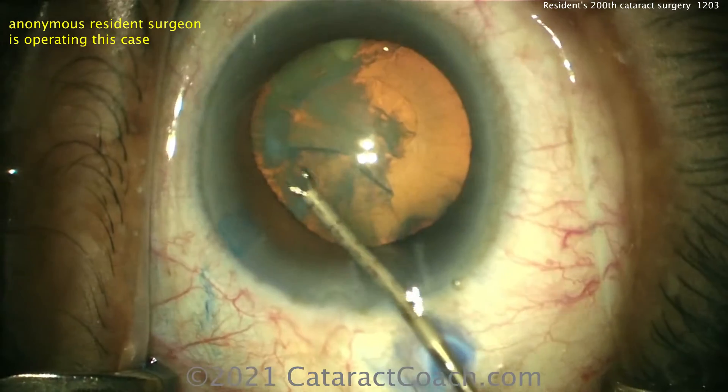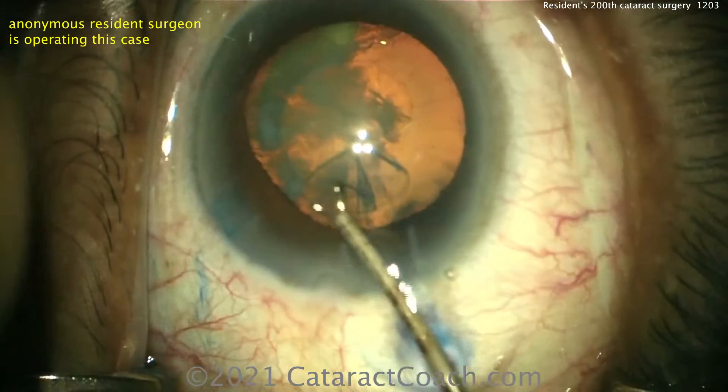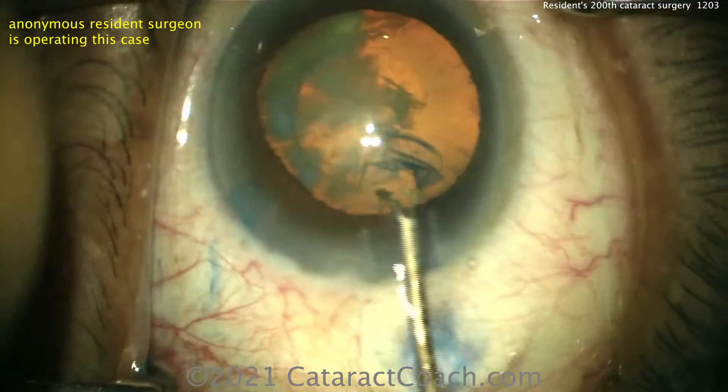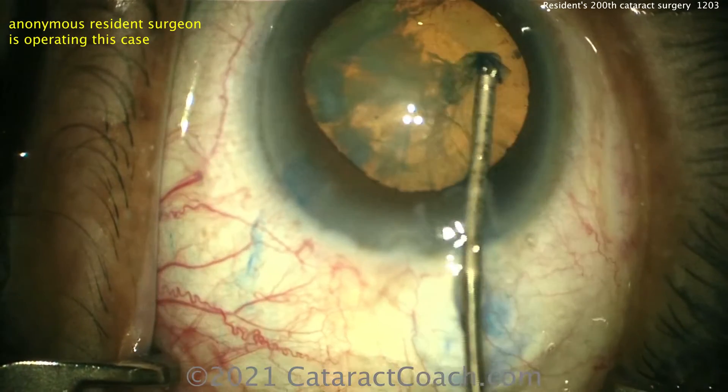Stick with that — obviously in this case a good five-millimeter rhexis. Continuing it here, good pivoting in the incision. These forceps certainly do make it a lot easier compared to traditional forceps.